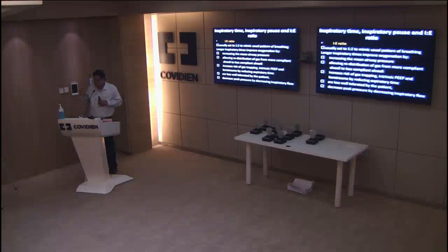So what I say is, if you're going to keep a rate, you can't keep setting it and forgetting it. Try and match the patient's own rate. Keep a rate which is about 2 or 3 breaths less than his own rate, such that he triggers. Because if you keep a rate too fast, the patient won't be triggering at all. You don't want him not to trigger. But don't keep a rate too slow, because then the IE ratios keep changing. And then they get auto PEEP, etc. So better to keep a rate which is closer to his rate.